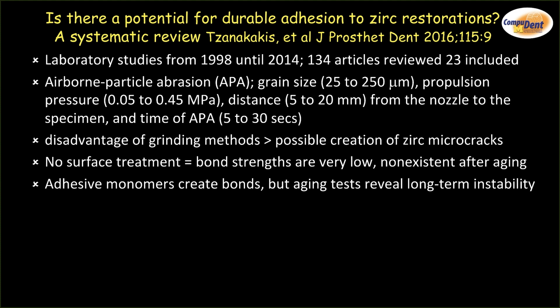So if we're leaning towards adding adhesives to our high-strength ceramics and our zirconia to improve the retention, what do we do with zirconia? Now, this is an interesting study, getting a few years old now. They looked at all lab studies from 1998 until 2014. They found that air particle abrasion was important to get a bond. Now, there's a little bit of difference on how big the particle size should be, what the pressure should be, what the distance should be, all these kinds of things. But the bottom line is you've got to use air particle abrasion.